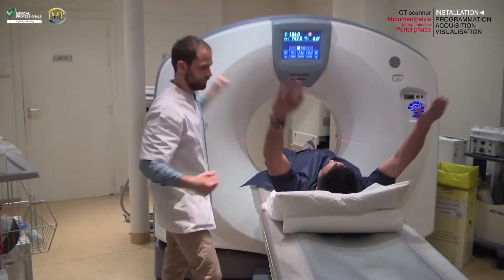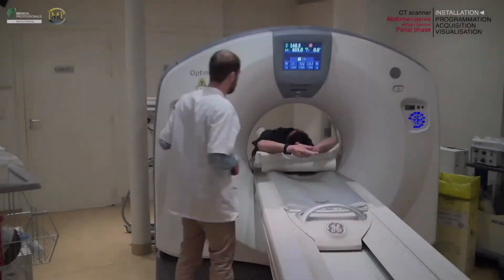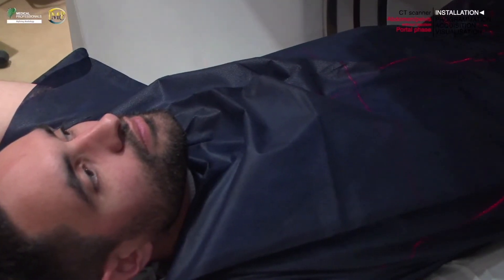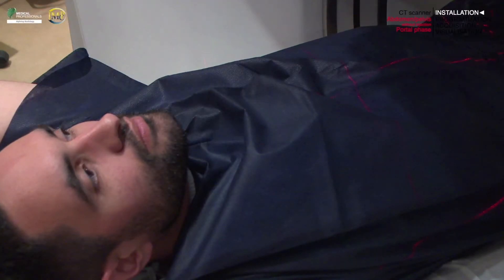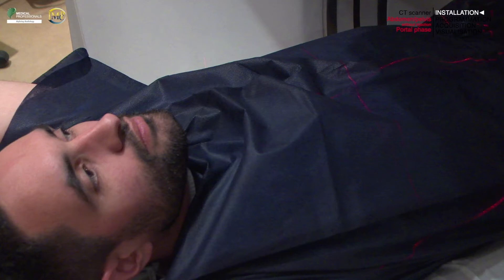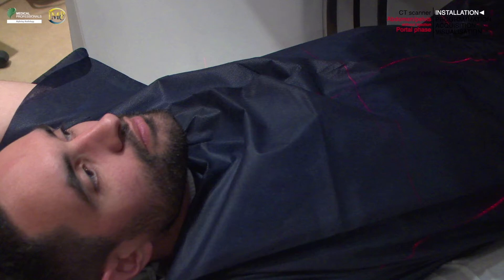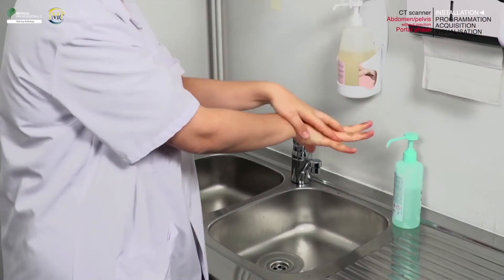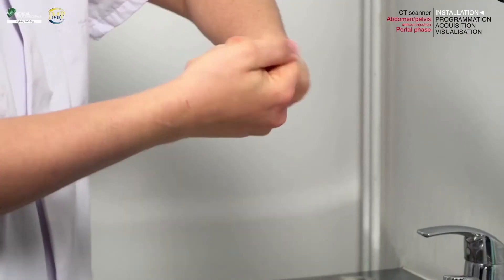Center the internal axial plane laser light on the appropriate landmark — here we use the xiphoid process of the sternum. Make sure that the lateral laser light is set at a mid-thickness of the trunk and that the longitudinal laser light is placed on the median sagittal plane. Remember to close the doors of the examination room and perform proper hand hygiene such as the use of a rub with alcohol-based hand sanitizer.